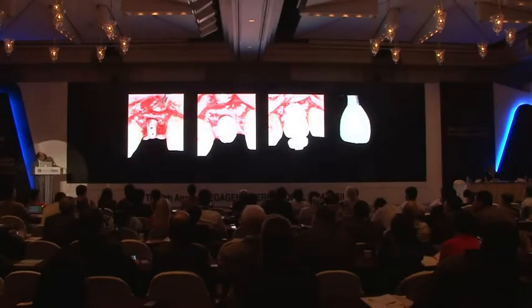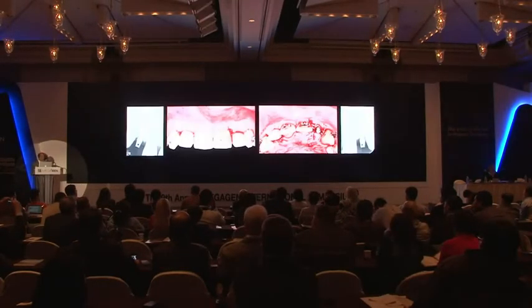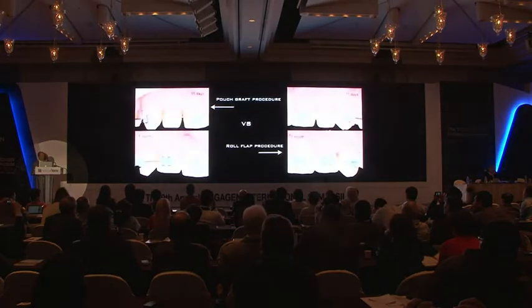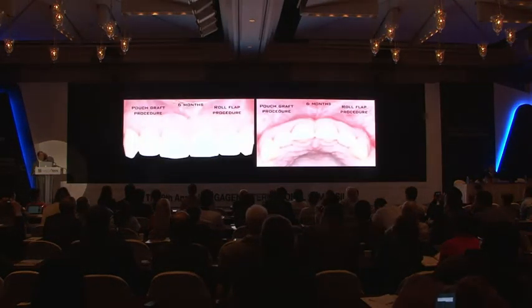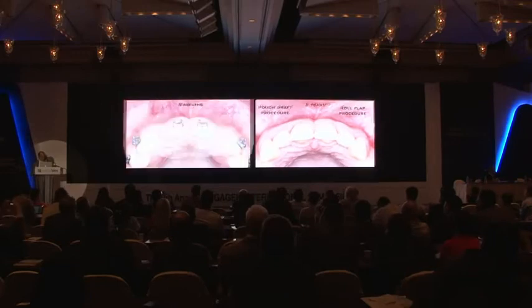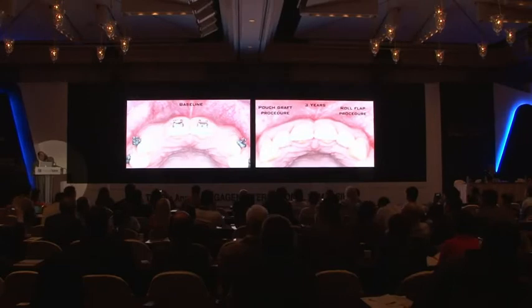The provisional restoration, the RX control, where we can see the subcrestal implant position and the very close teeth. 15 days after control. 6 months after control with the final restoration, where we can see how both sides had a good healing of the soft tissue regardless of the regenerative technique used. The follow-up 3 years after with the maintenance of the soft tissue.